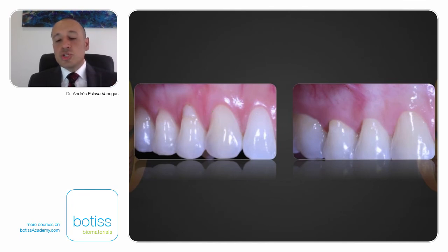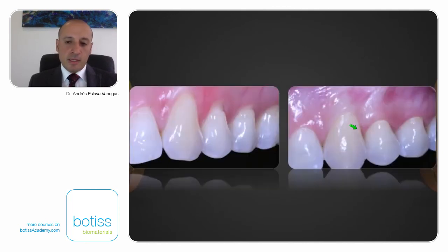So I want to show you before and after pictures. This was at the beginning. This was 2 years after the surgery. You can see the biotype. You can see the gingival recession almost covered, maybe 95 to 96%. And at the other side, look at the papillas. Okay, look at the biotype, a thick biotype. Look how thin it was at the beginning.